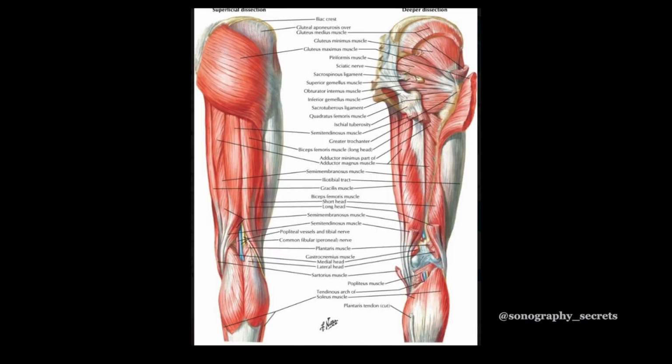And the last thing to forget is Frank Netter. I always get very nervous when I see someone go to Frank Netter before they have to perform an MSK ultrasound examination. Now, I've got nothing against Frank Netter. These are spectacular illustrations, but they're also very overwhelming because of the amount of information that's present. If we're looking at this before we go in to scan a hamstring, it's very easy to become overwhelmed. It's very easy for our game plan and our process of thinking to become clouded because we've become so overwhelmed with the amount of information that's present here.